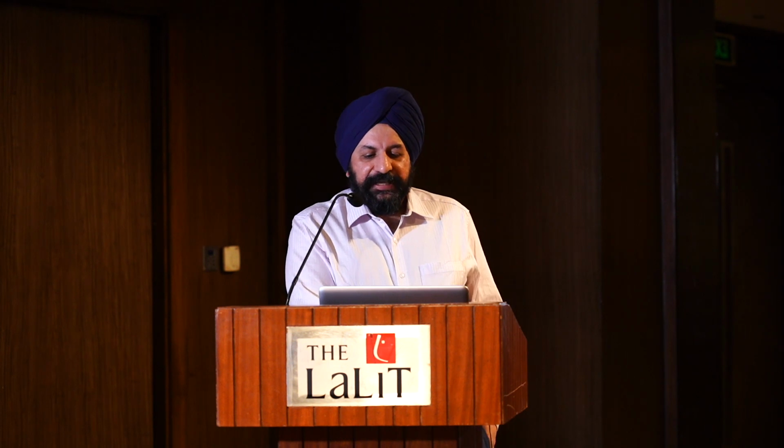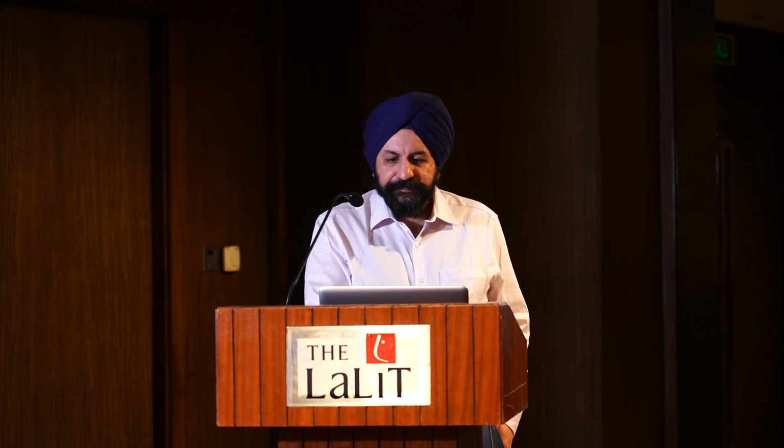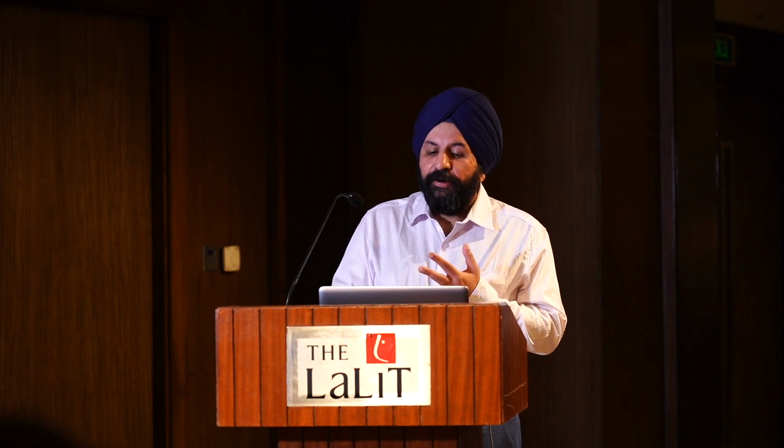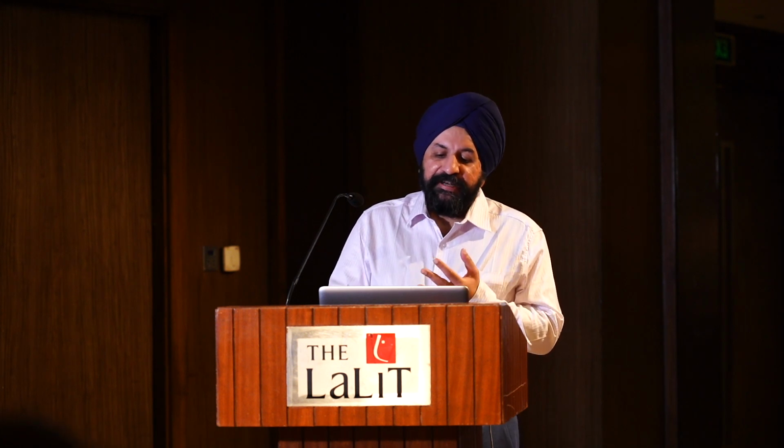So as I said, it is depicting both higher fluorescence as well as more RNA. So these are the ISLH guidelines. If your platelet count is less than 1 lakh or more than 10 lakhs, if there are any flags coming out of your analyzers, especially if there is a platelet clump flag, you have to check the sample for clots, you have to do a slide review, and if clumps persist, then follow the lab SOPs.